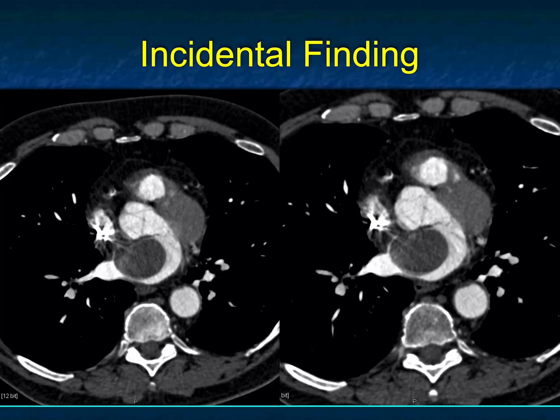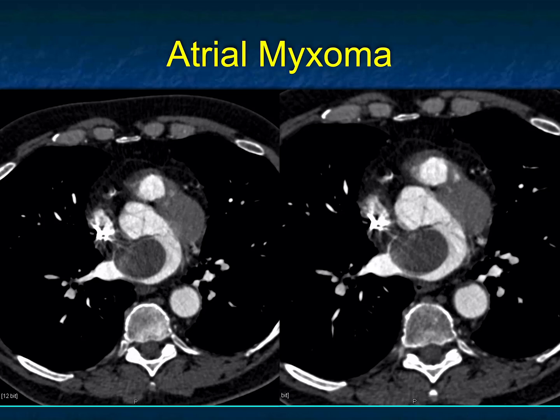Here's a patient with a large mass in the left atrium, just abutting the right atrium at the groove. What could this be? It could be a thrombus, but that would be a big thrombus — and thrombi are more irregular. This was, as you might guess, an atrial myxoma. Myxomas can occur in any chamber, but the significant majority occur in the left atrium. This was a large, maybe five-centimeter, atrial myxoma, shown again nicely on coronal views.